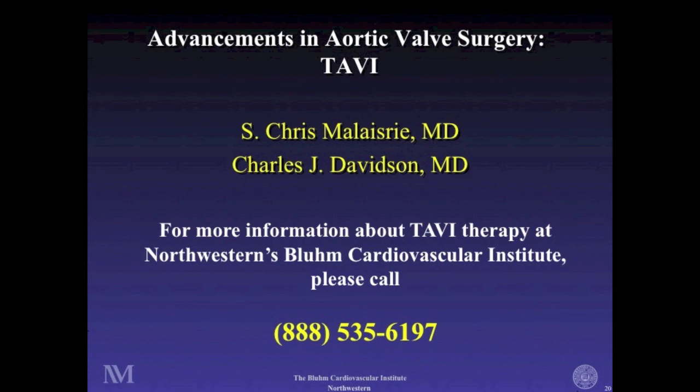My own bias at this point, my own opinion, is that the technology is early. Some of the things we talked about, like stroke and vascular complications, need to get better to be competitive with surgery for all populations. If we can do that, there's a good possibility. If we can't, then surgery will remain the treatment of choice for the lower risk patients, and really the question right now in the intermediate risk group is which one of the two is superior, and that's what we're trying to study. But it is a terrific question that I think will take five years to sort out, and may take up to 10 years.